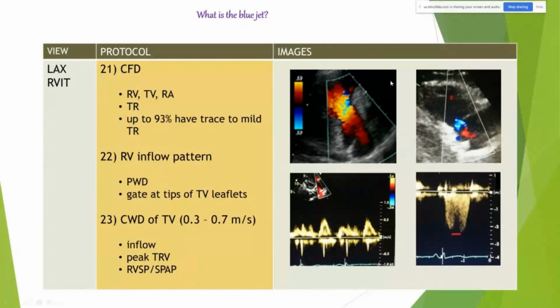Don't worry about that for now. Right now, just know that we get an RVIT image, and we use continuous wave Doppler most commonly. You could use pulse wave Doppler, but not many places I know actually even focus on that. For now, this is where I'm going to stop for today.